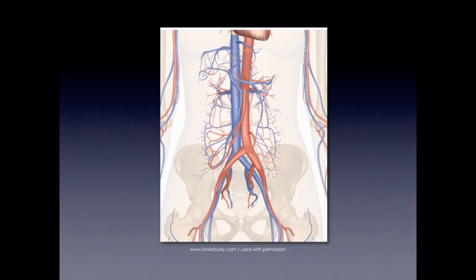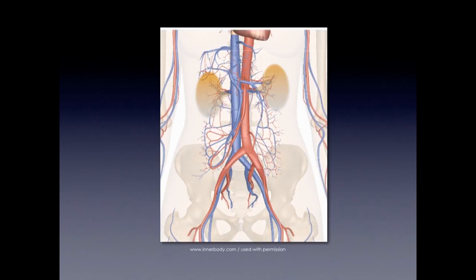We're mainly going to be looking at the abdominal aorta in this region, going from the celiac trunk to the bifurcation, paying specific attention to the infrarenal portion of the aorta, as the majority of aneurysms occur in the infrarenal region.